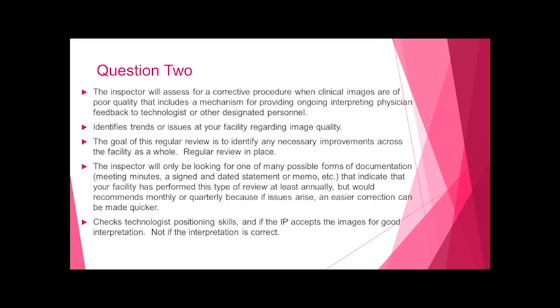They randomly pick images of a patient and we go over them together, and they tell us if it's good or not, and if it's not good, what needs to be improved, and they want you to make these corrections regularly, because they don't want to go over this review only once a year, even though that's the minimum required, because you want to catch these areas sooner. You don't want them to linger on.